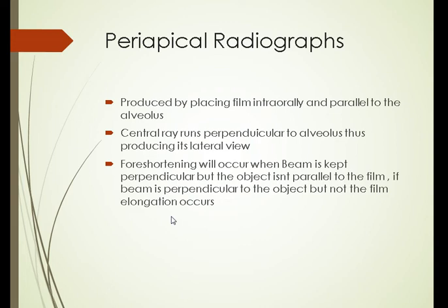If you are a doctor and you're doing it yourself, you're taking the x-ray, so maybe you can foresee those two things, but you don't. We have our assistants come in, they do these things, and we have no idea which of those two happen. All we know is everything was done perfect, everything was perpendicular, the film was parallel, and we see what we see.